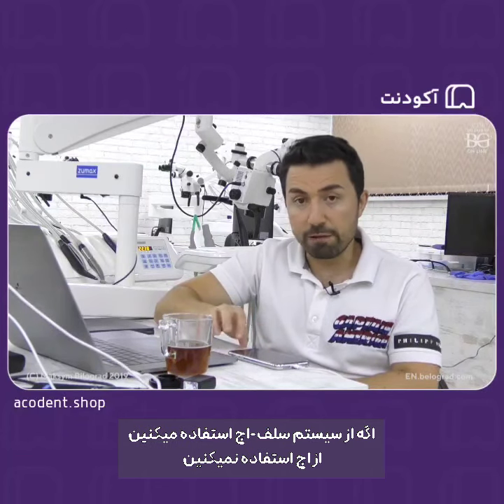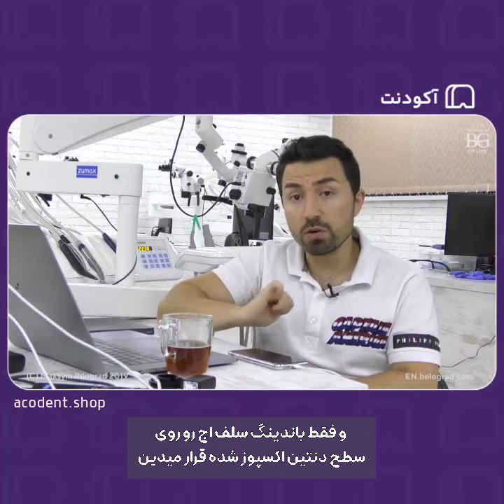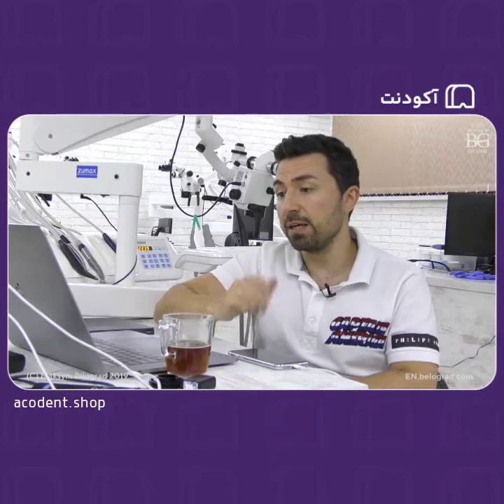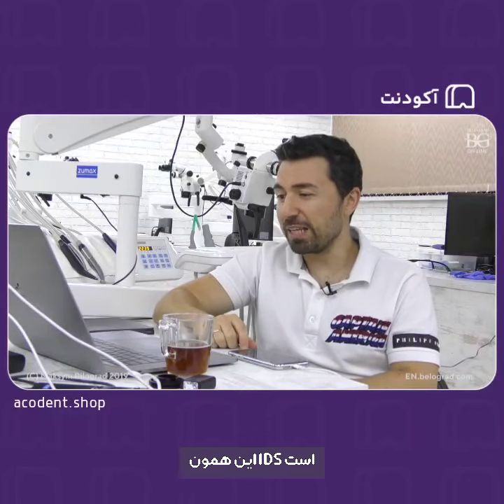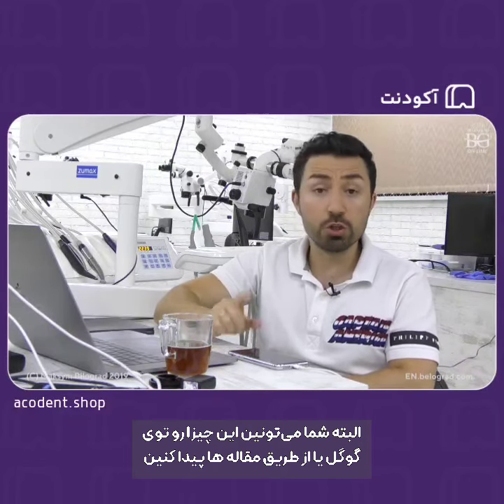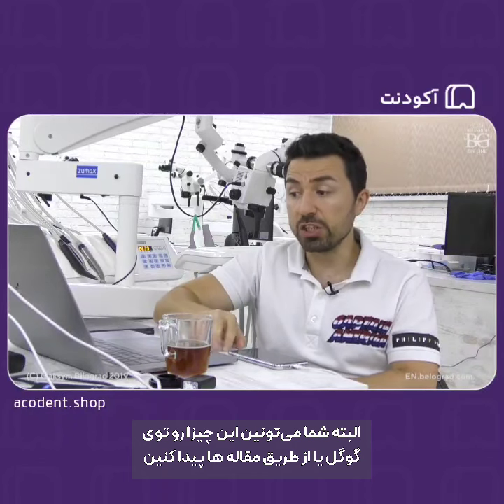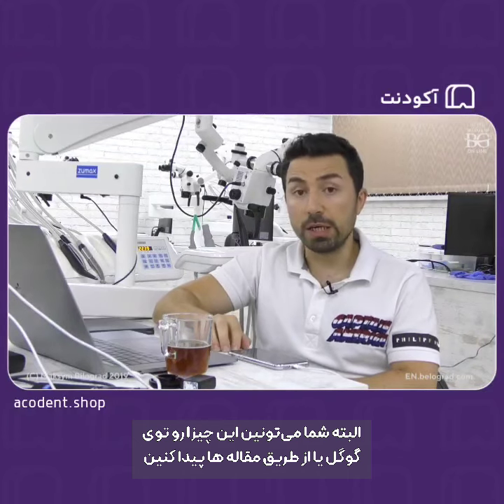If you use a self-etch system, you are not etching, you just apply your self-etch bonding over the surface of exposed dentin, and that's it. This is immediate dentin sealing. Actually, you can read an article. You just Google it, IDS. Google IDS or immediate dentin sealing by Pascal Magne, and you may find a PDF article on the internet.